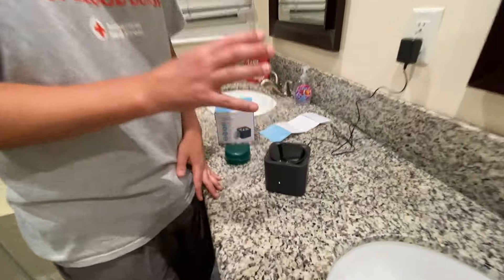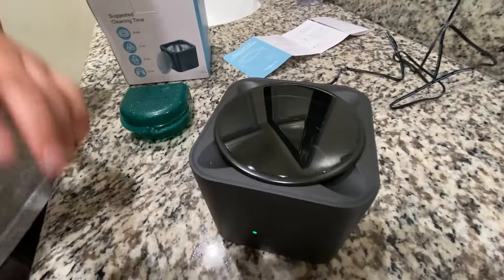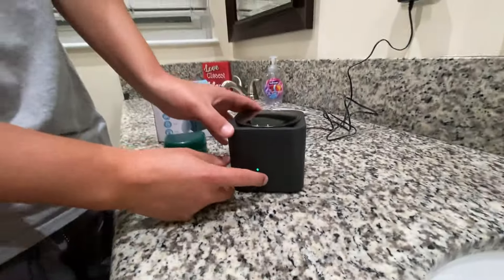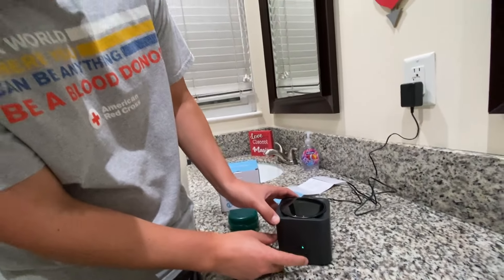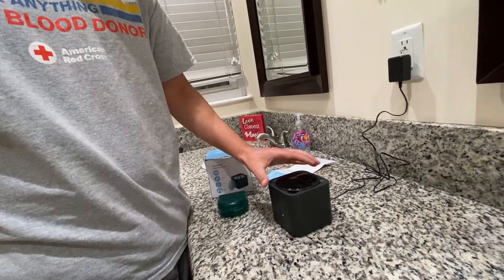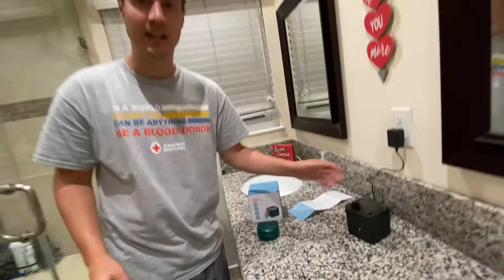It cleans by vibrating, so it's going to shake it. It's very hard to tell visually, but it is cleaning it. I'm going to go ahead and set it on the 10-minute mode, and then we'll let it clean and show you guys the final product.